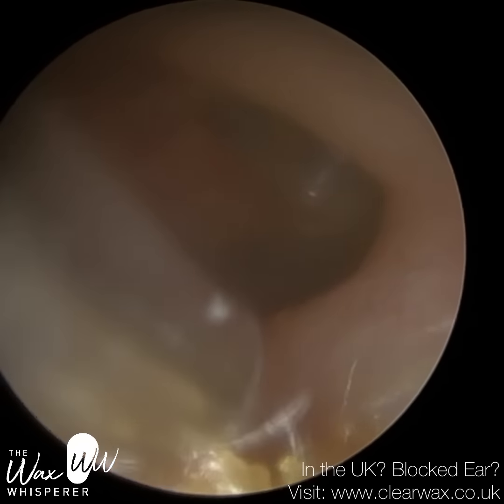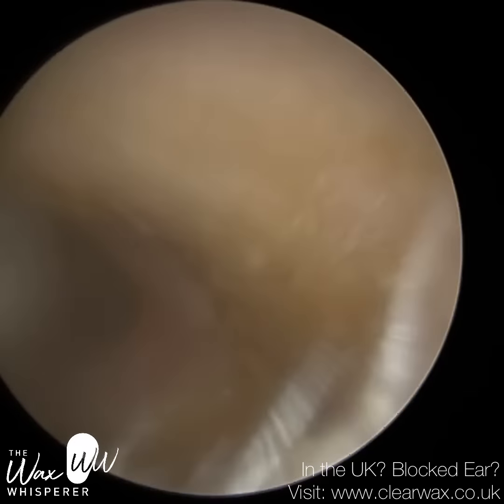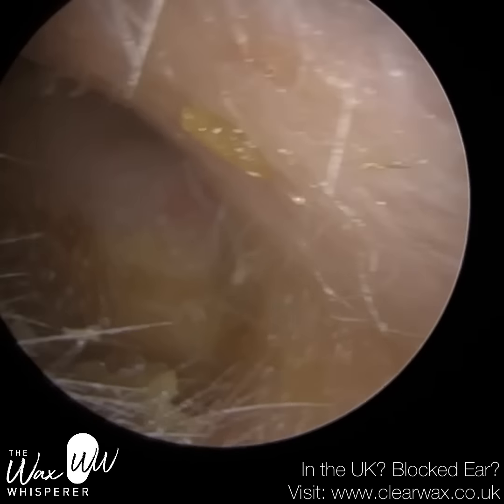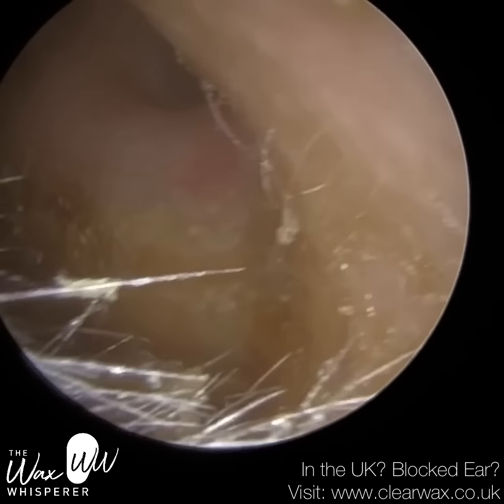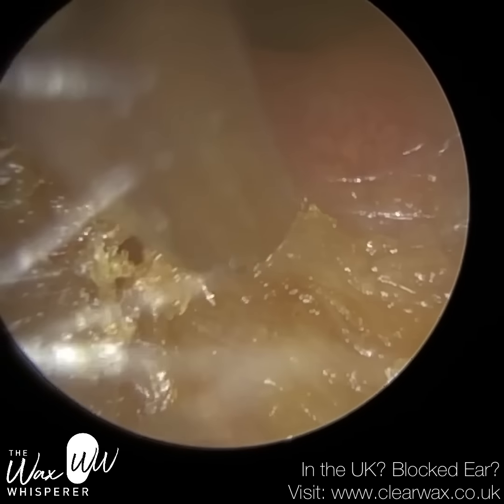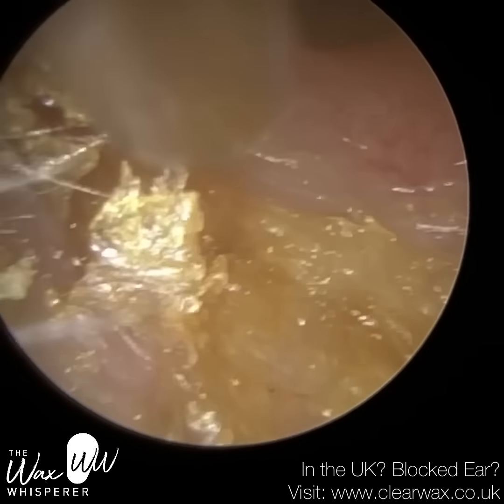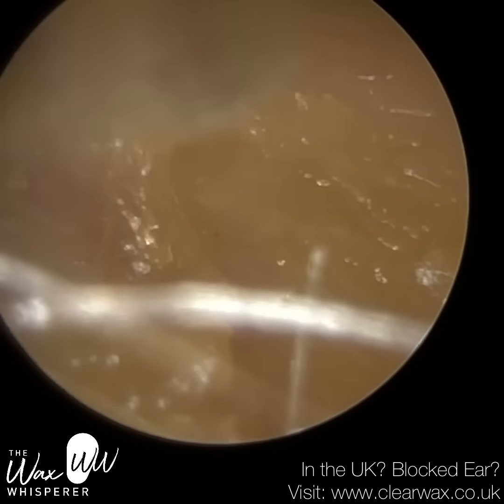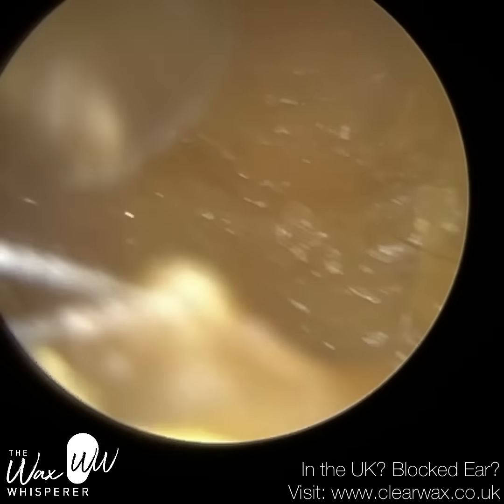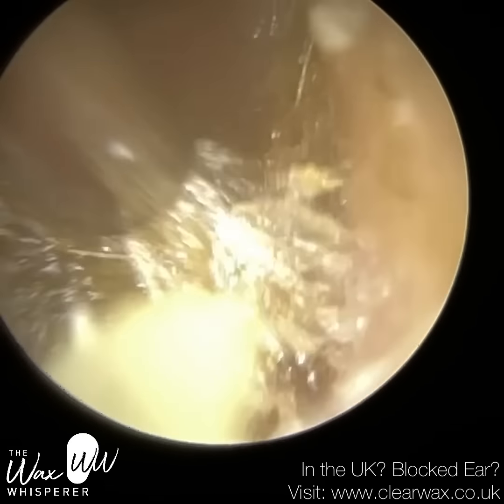It's a smaller suction probe, narrower diameter, so it's less power. However, because it's a smaller surface area, the suction is more concentrated. So in a roundabout kind of way, it does sometimes provide better suction compared to the full Zollner suction probe, where the suction power is more diffused, whereas this is more concentrated.